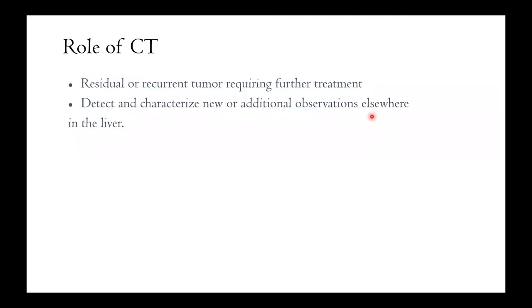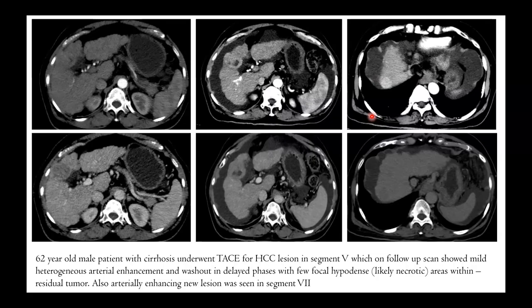The role of CT is to look at residual and recurrent tumors and detect any new lesions. Here we can see a 62-year-old male patient with cirrhosis who underwent TACE for this lesion. On post-TACE CT, there is still an arterially enhancing component, washout on portal venous phase, and necrotic hypodense areas within. There is also evidence of a new arterially enhancing lesion in segment 7.